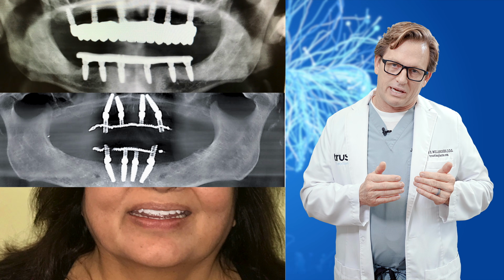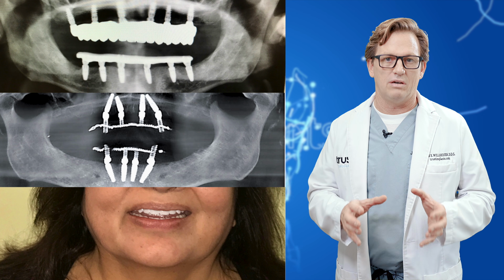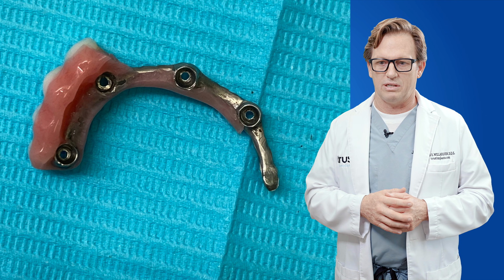Putting implants in the back of the jaw, having an implant in those first or second molar positions, now all of a sudden you've changed the dynamics of the bridge. You've changed the dynamics of how this functions. And you can see that the bridge is broken here.